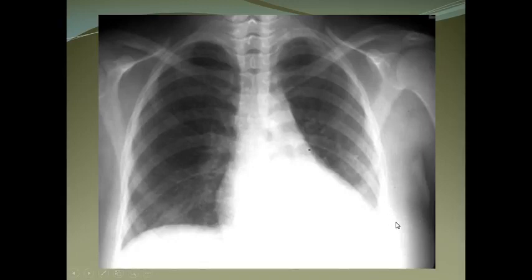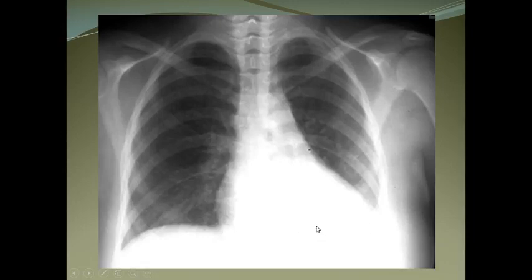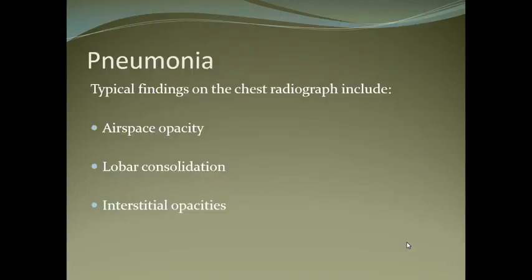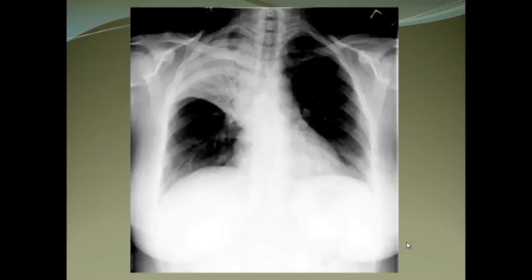This is a case of cardiomegaly along with some pleural effusion on the left, indicated by blunting of the left costophrenic angle. The heart is more than 50% of the thoracic width — measured by drawing a line across the heart and comparing it to the full chest wall width.